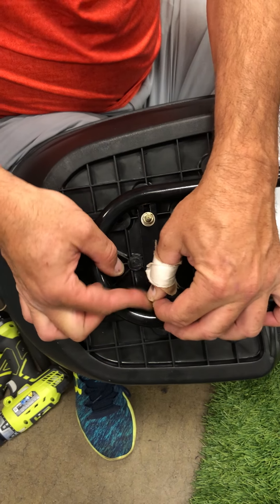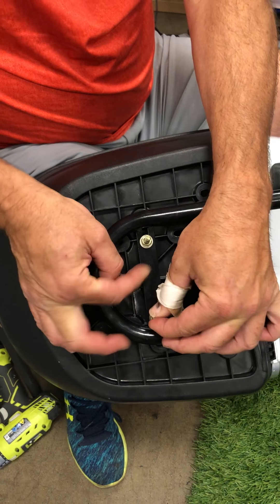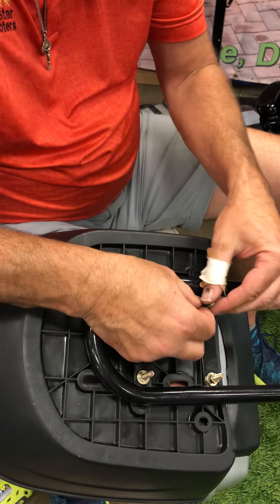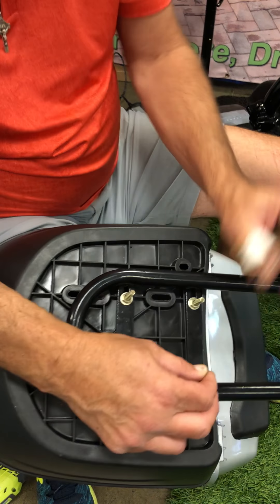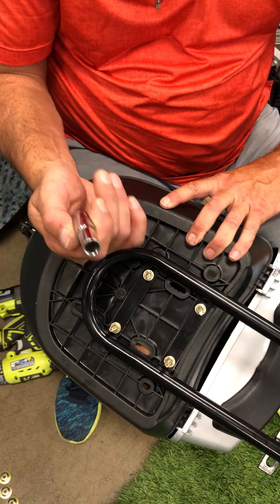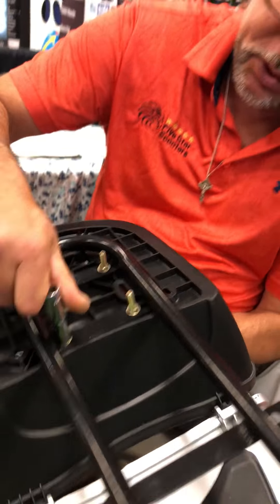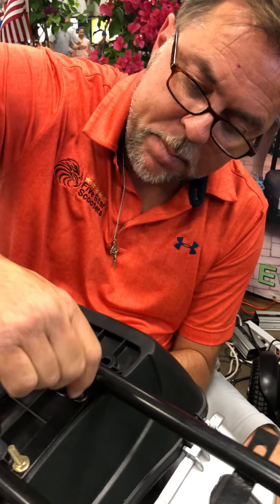I go ahead and finger tighten these down as they're all in position as best as I can. Then I just use this — or you could use any kind of a wrench. That nut is, I believe, a 10 millimeter. I just hold the screw either with a screwdriver or my finger and go ahead and tighten them down.